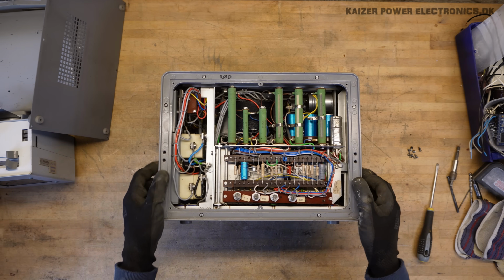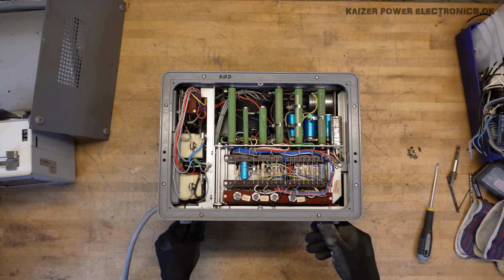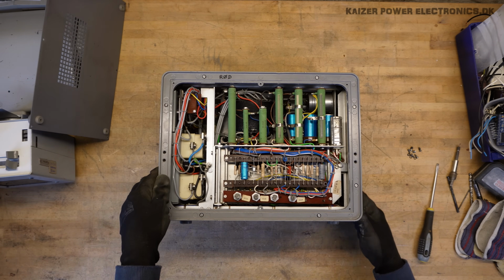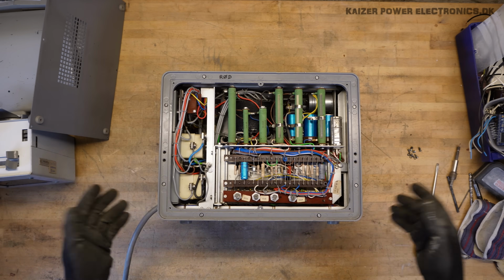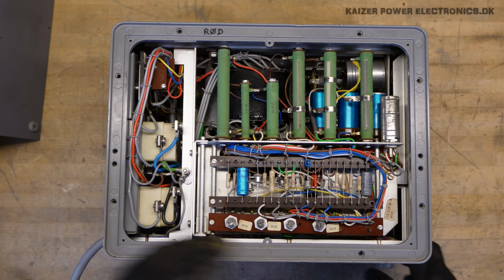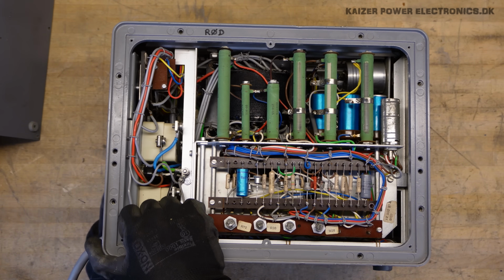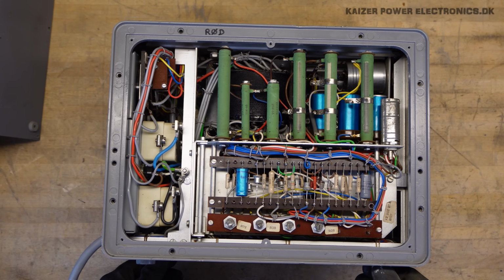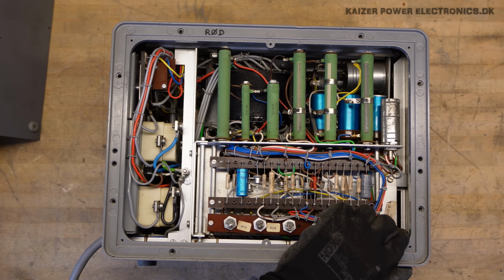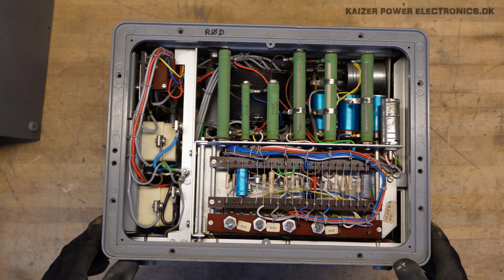So I guess having to dive deeper into this, we'll have to... there's not really any screws on the front or anything else, so maybe it's just this frame here and it kind of falls apart. Okay, it wasn't just that. Actually, that frame is going nowhere. But the panels and the bottom panel here are all loose now. I wonder how this is actually put together. Ah, it's one of those lovely mysteries.